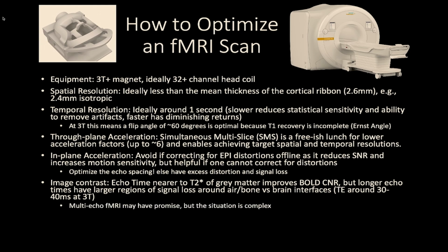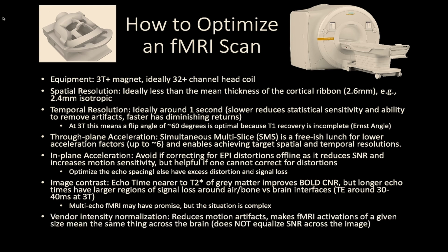And multi-echo fMRI certainly has been pitched as having a lot of promise. I can tell you that I've played with it on several occasions and still have yet to have it beat optimized single echo fMRI, but I'll keep trying. It certainly theoretically has benefits.